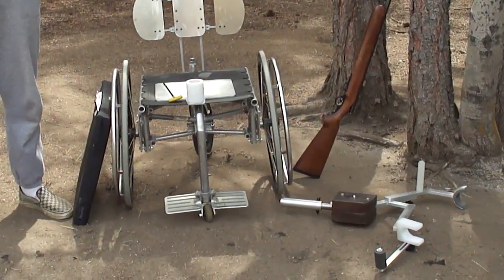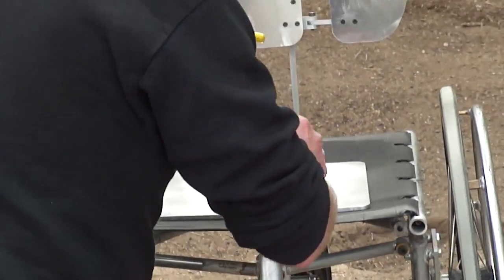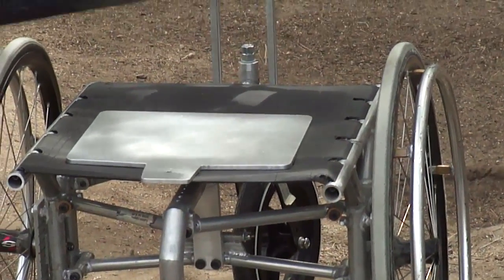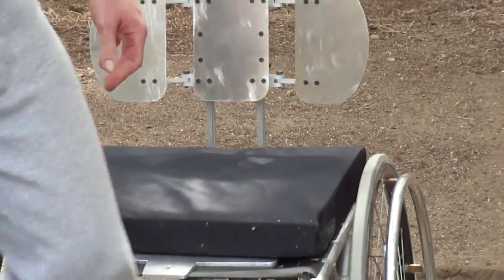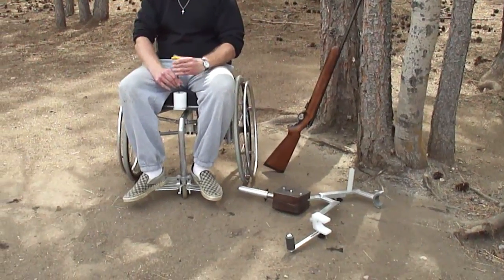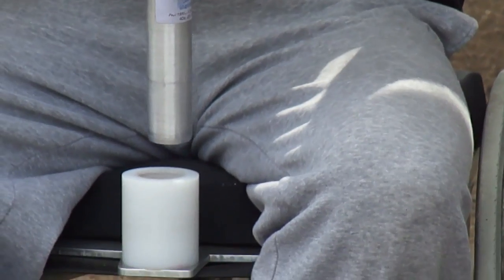How it works is you have an aluminum sheet that sits on the seat of the wheelchair with a boss at the front. What you do is unscrew and remove the boss. Now set the seat cushion down. Have a caregiver set you down on the seat and reinstall the boss. Your weight will keep it stable.